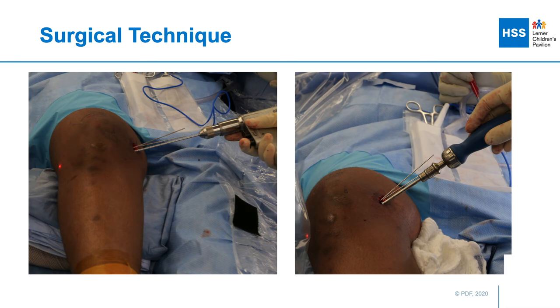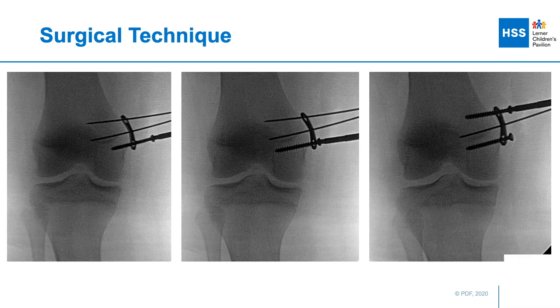I like to use solid screws, but when I drill I use a cannulated drill bit. I first drill the epiphyseal screw in a cannulated fashion, then the guide wire is completely removed and the epiphyseal solid screw is placed. Because there's a proximal metaphyseal guide wire as well as a central wire in the plate, the plate shouldn't rotate out of position while removing the guide wire and inserting the screw. I then advance the screw down to the level of the plate, but do not tighten it.